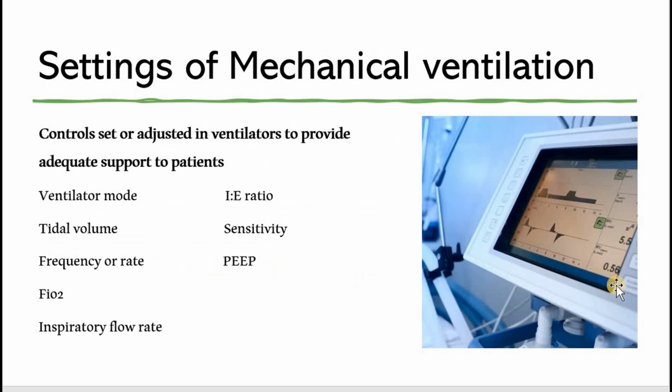What are settings? Settings are numbers or parameters adjusted or set in the ventilator to provide adequate support to the patient, and the settings are ventilator mode, tidal volume, frequency or rate, FiO2, inspiratory flow rate, IE ratio, sensitivity and PEEP. Now let's see settings in detail.